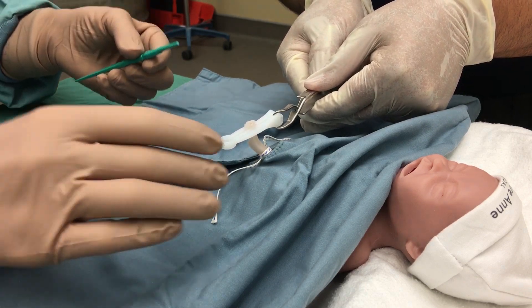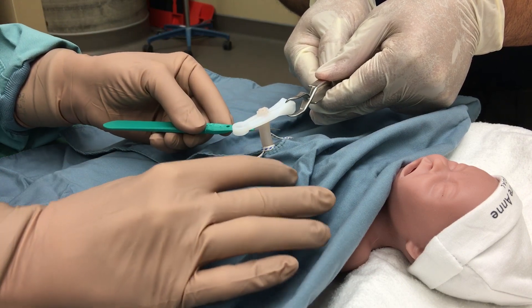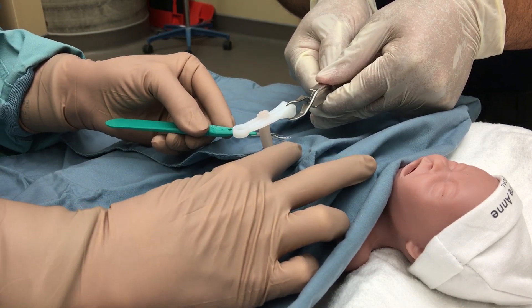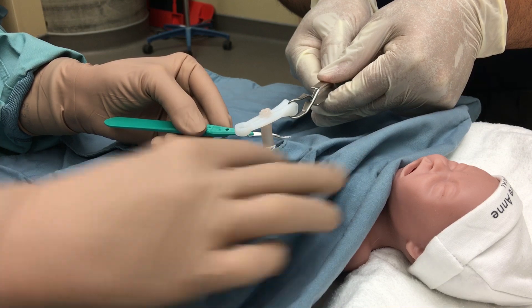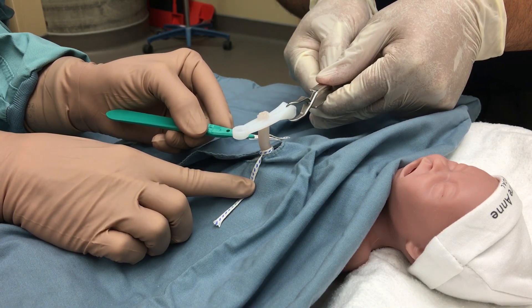With our assistant holding the cord as vertical as possible and straight, we're going to try and do a very horizontal cut, trying not to do any angling, approximately one centimeter to one and a half centimeters above the cord base.